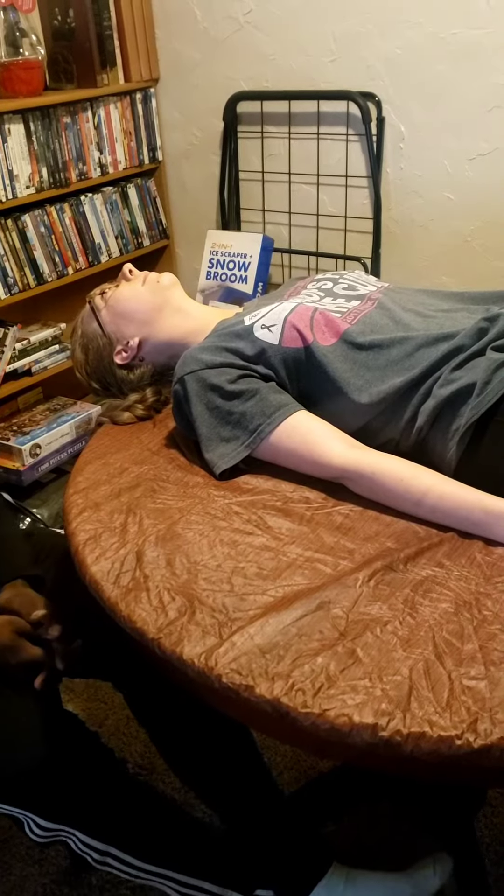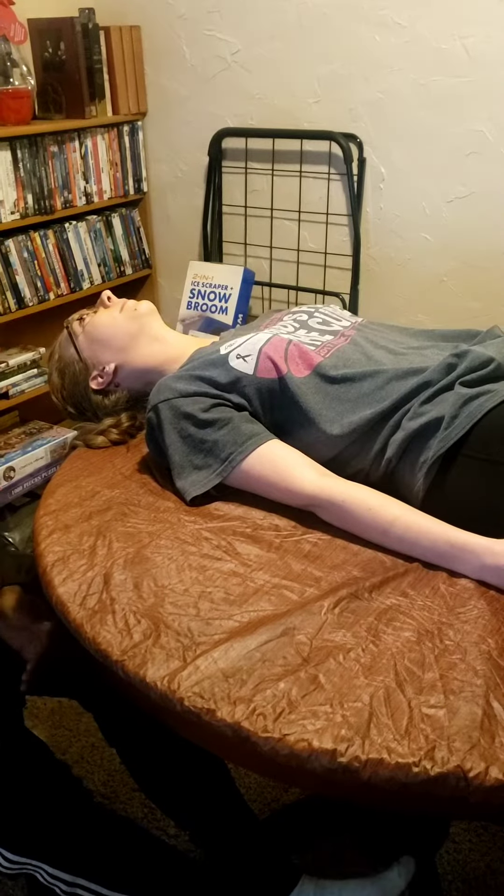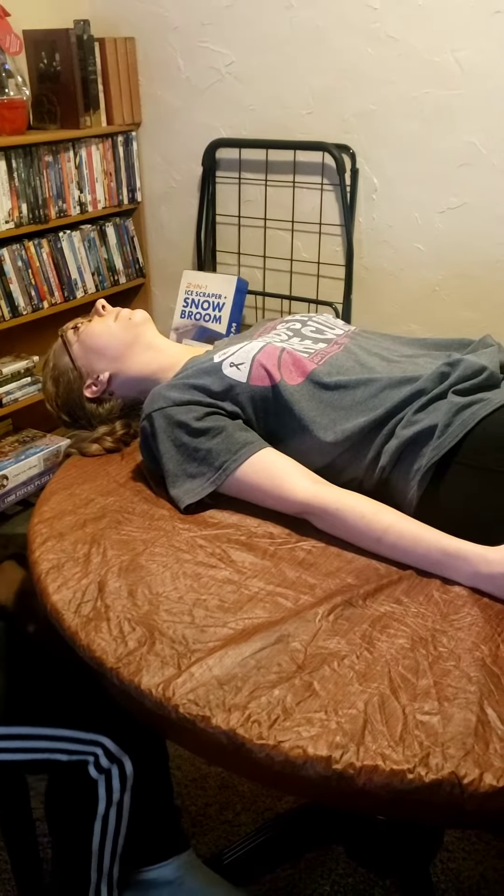To measure the range of motion of joints, I have my client lay down supine, or on her back. I'm going to use a goniometer to measure the joint range of motion. The first one will be for the shoulders. I'm going to have my client keep her arms straight as she reaches all the way back to her head. The fulcrum will be at the armpit, measuring at the shaft of the humerus.